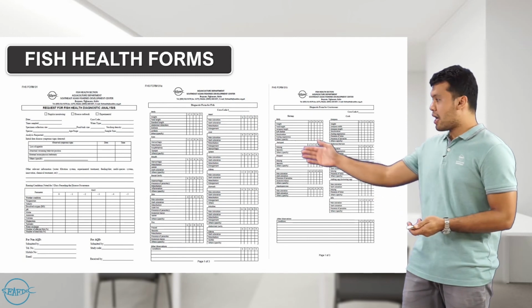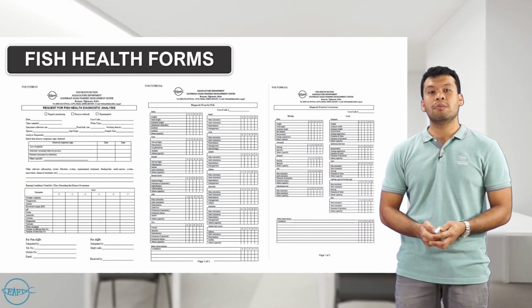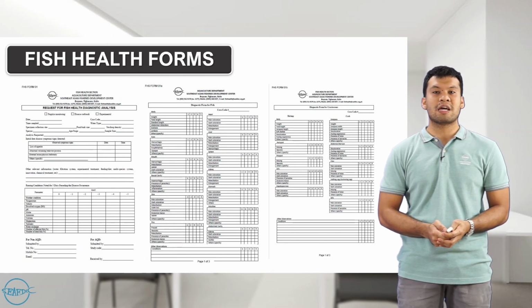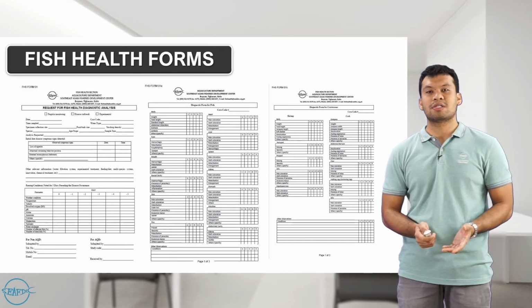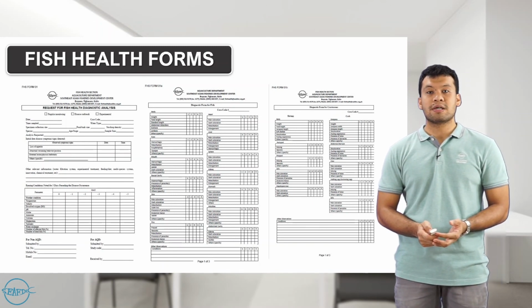Also for your crabs, we have almost the same type of diagnosis form, but since we have different types of tissue samples in your shrimp and in your crabs, we also check those types of changes upon sending your samples to the laboratory.